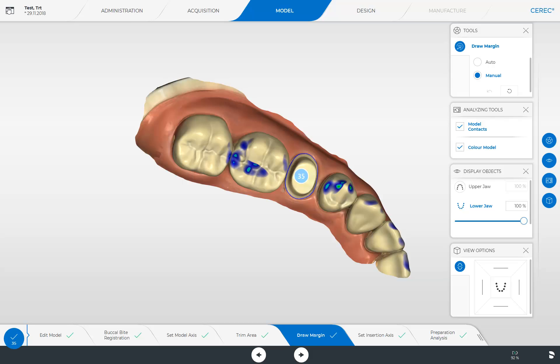Next, we go back to our functions in the side panel. By enabling the model contacts, we can better assess whether the patient found the correct occlusal bite during the buccal scan or whether possible early contacts are present. To switch to the next phase, the design phase, tap either the corresponding button in the phase menu or the forward arrow at the bottom of the screen.